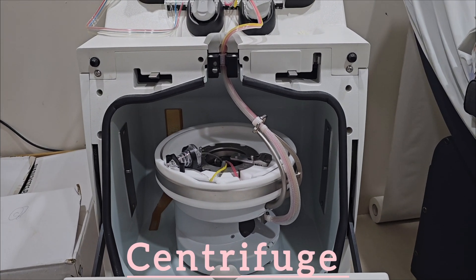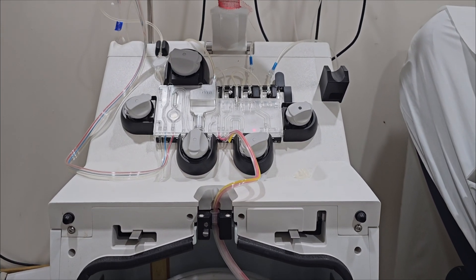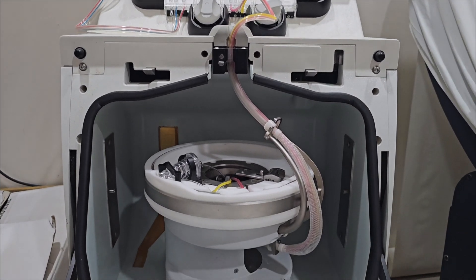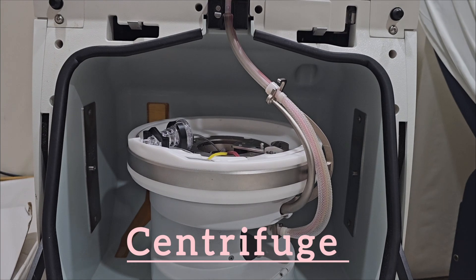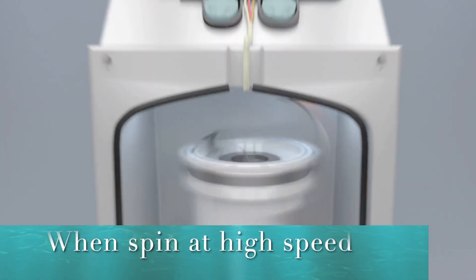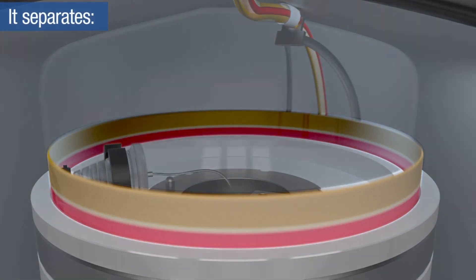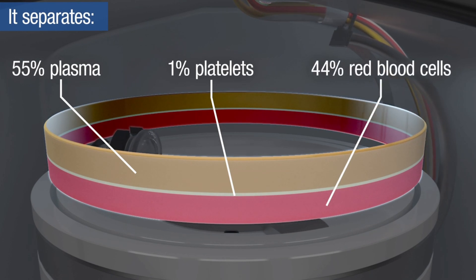The heart of the apheresis machine is the centrifuge chamber. In the centrifuge chamber, when the donor's blood spins at high speed, blood components are separated and platelets are removed.